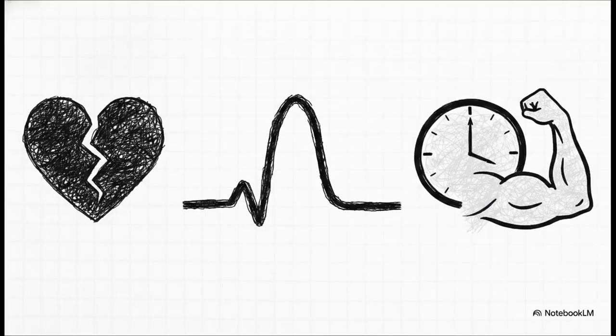And when that oxygen starvation evolves into a full-blown heart attack or myocardial infarction, the rules become extremely strict. The universal definition for an acute ST elevation myocardial infarction, a STEMI, requires ST segment elevation of at least 1 millimeter in 2 contiguous leads. The chest leads V2 and V3 are so sensitive that the criteria actually vary based on age and biological sex. For example, it requires 2 millimeters of elevation in men 40 and older. We're also on the lookout for pathologic Q waves and reciprocal ST depressions in the opposite camera angles. Rapid identification here dictates immediate, life-saving reperfusion therapy, because when it comes to this, time is muscle.